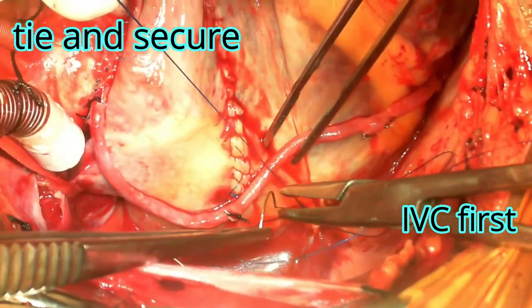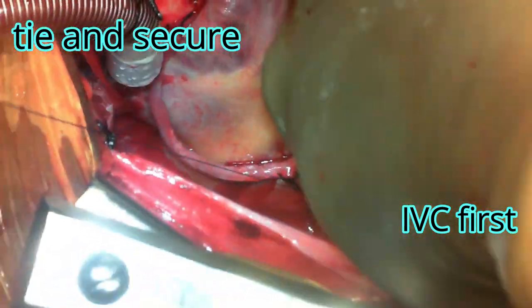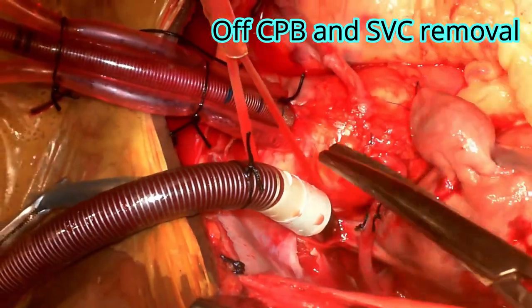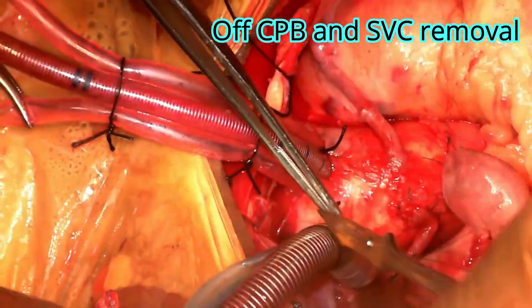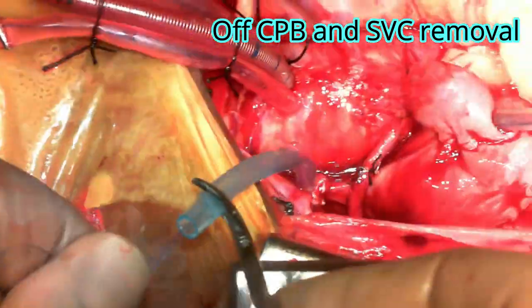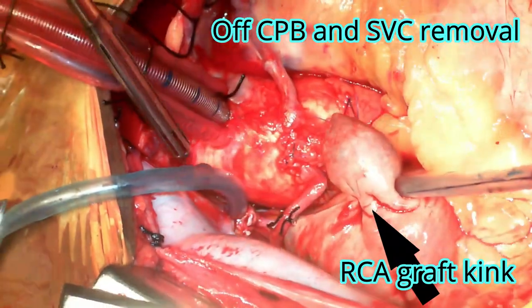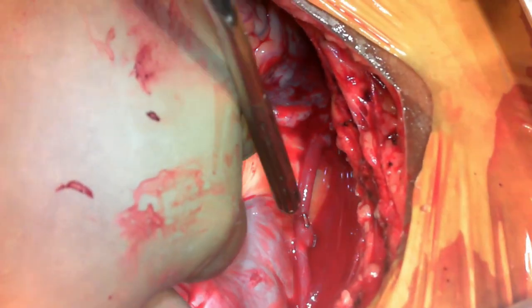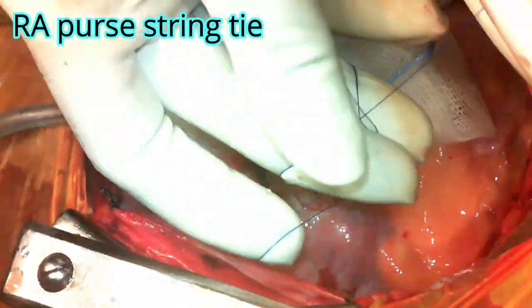Once the IVC is secured, pay attention to the rest of the hemodynamics while leaving the SVC cannula in situ. Note that in this case the graft to the RCA has a kink — you can see that. Once hemodynamics are good and the patient is coming off bypass, remove the caval tapes and then remove the SVC cannula. With the SVC cannula removed, you are ready for protamine administration. Here the RCA graft was kinked and was reconstituted off bypass by placing a side-biting clamp. If you are not using the RA cannula, tie off that suture; if you are using the RA cannulation site, that will be the last suture removed after administering protamine.